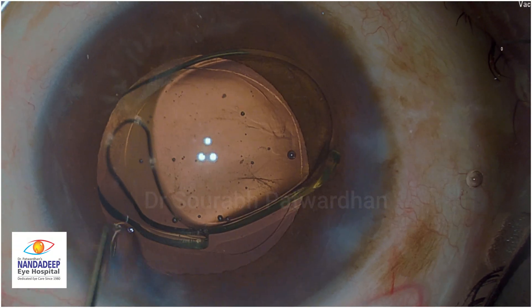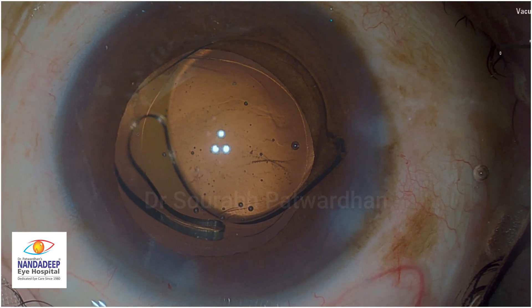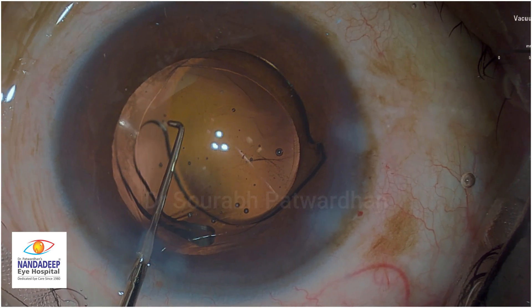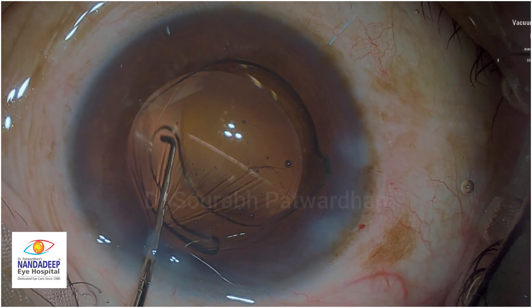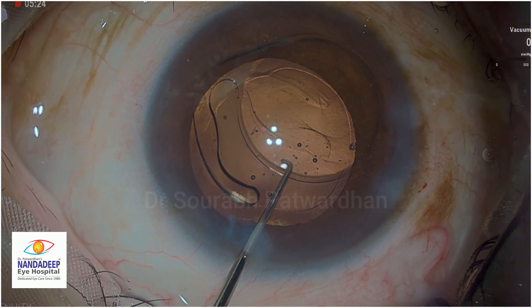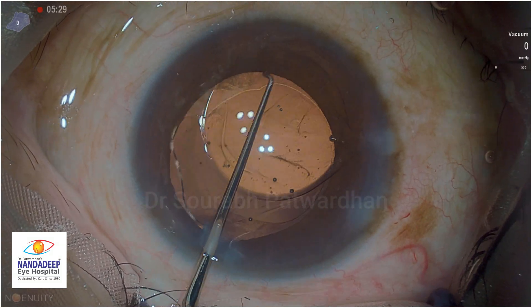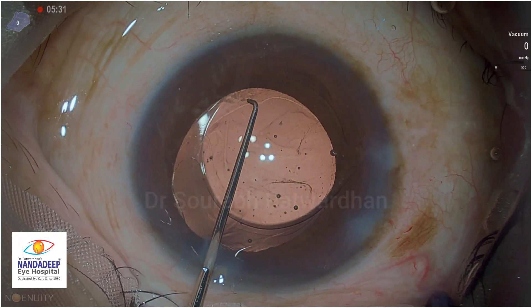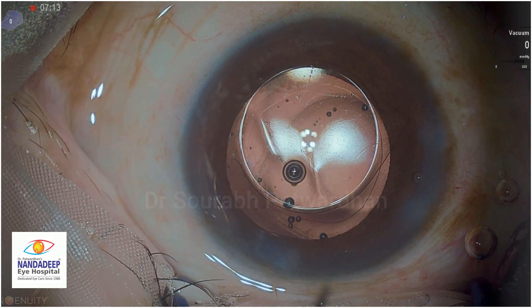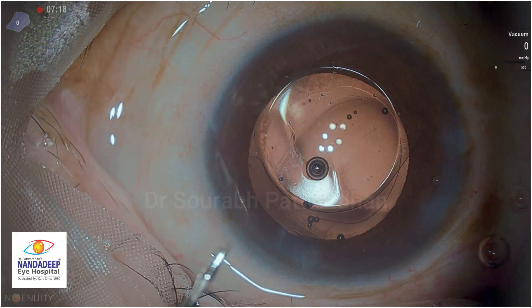You must have noticed that the trailing haptic is cut. There was some issue while loading the cartridge - this is a butterfly type cartridge which was used. I want you to see my video on how to use the butterfly cartridge so that the IOL doesn't get damaged during insertion. Nowadays my OT assistants are loading the IOL so that I can finish surgery quickly, and it has been very good so far. But occasionally there might be some issues in loading the IOL, so you have to be careful as you load.